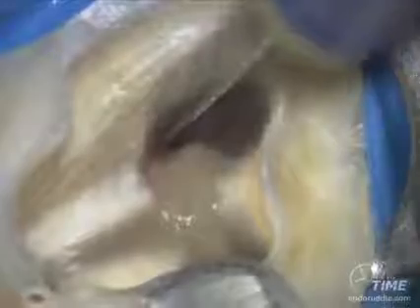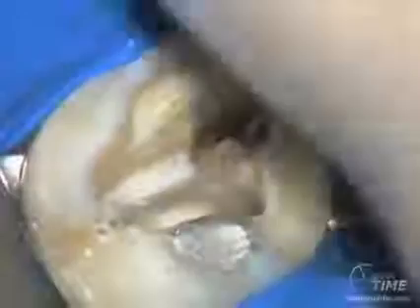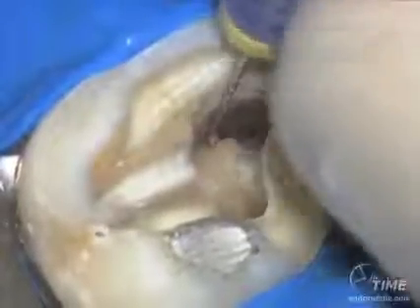The MB2 is too small at this point to accommodate an X Gates or a ProTaper Shaper X, so I have to go through a series of hand files very rapidly, turning them clockwise, then counterclockwise, so I can make some space. I don't want the instruments to feed deep into the canal. We're only trying to make some space in the coronal third of the root. So by using a series of hand instruments, clockwise, counterclockwise, cut, back them out, cut in, back it out, I can make a little shape restricted to the coronal third of the root.